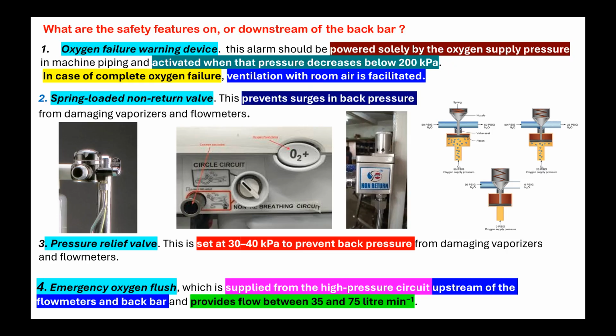Which condition can trigger high temperature in the patient, rigidity? Malignant hyperthermia. Okay, if in case you suspect malignant hyperthermia, you can disconnect the patient from the machine and then remove all the anesthetic agent that may be present in the breathing circuit by activating this oxygen flush.